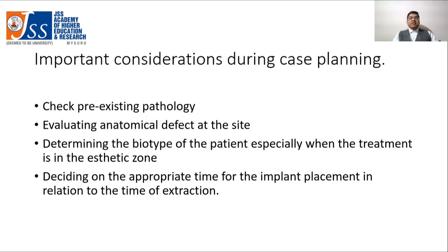What are the important considerations which we need to take care while planning implants? During the treatment planning stage of implants, special attention to be given to assess the proposed implant site as well as other systemic factors that may influence the performance and survival of the implant.